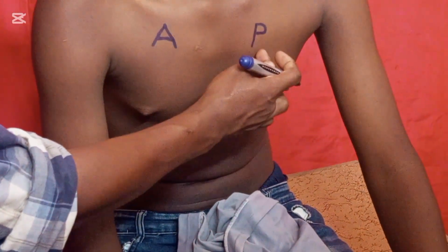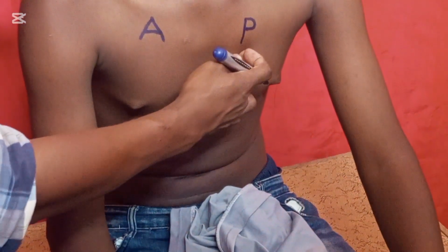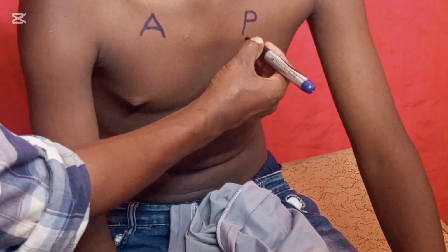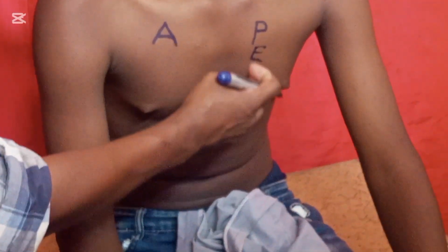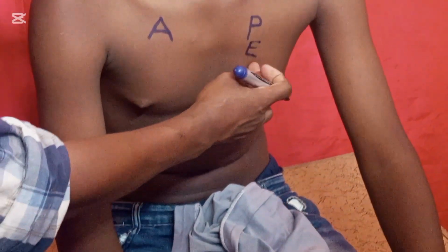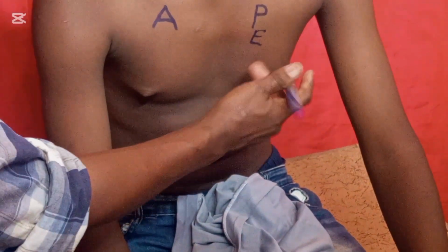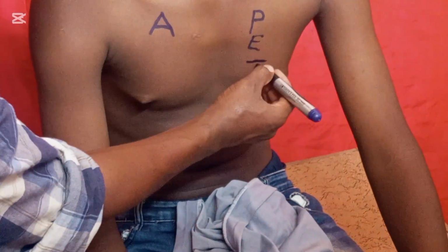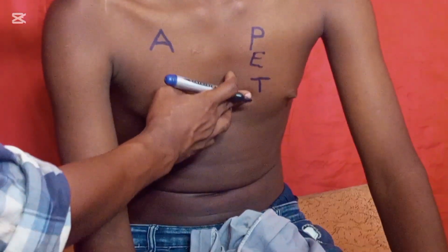Then we move into the third intercostal space on the left side of the sternum. Here we find the Erb's point. Then we move down into the fourth intercostal space on the left side of the sternum. So here is the tricuspid valve. Here is where we find the tricuspid valve.